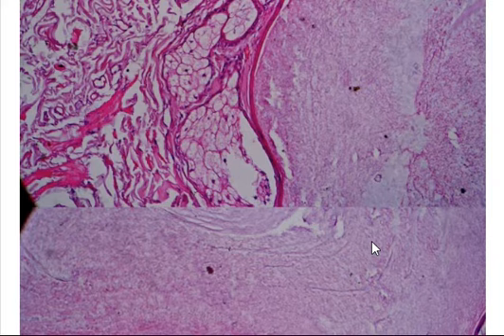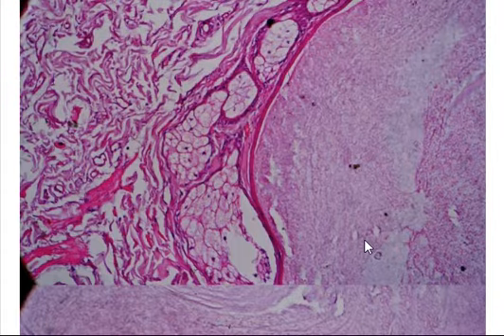Now, I will share a link to another talk I've given on acneiform eruptions on the seborrheic areas, and there I've explained in detail the different types of cysts that one may get from blockage of the follicular sebaceous unit at different levels. So just because one may see vellus hairs within the cyst cavity does not mean that this is not a steatocystoma multiplex. This is in fact steatocystoma multiplex, but there are no vellus hairs within this cystic lesion.